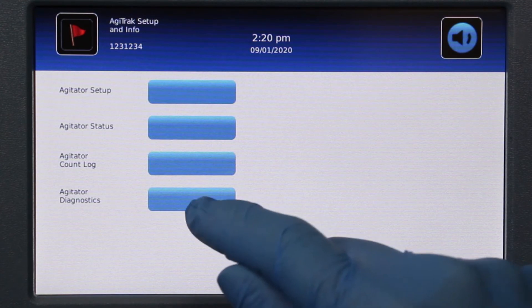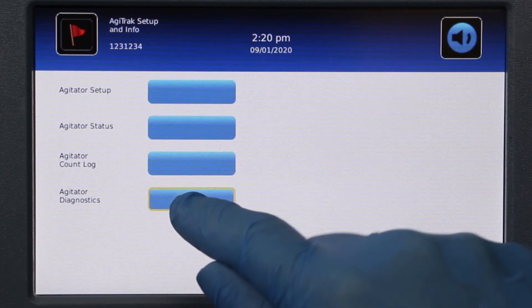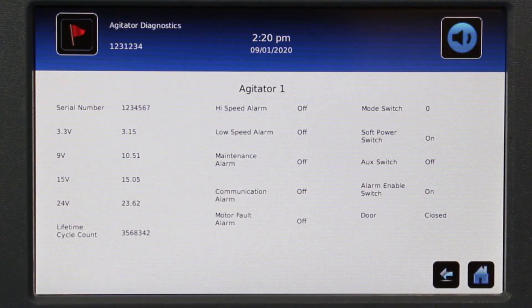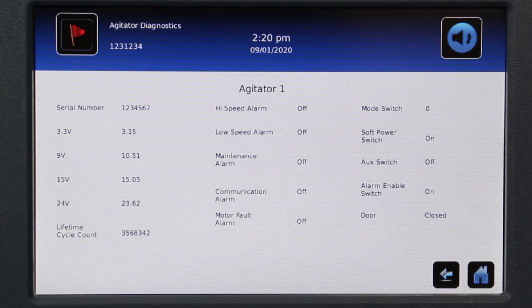The Agitator Diagnostics screen provides information regarding the operational status of the installed agitator. It summarizes settings and provides a lifetime cycle count.